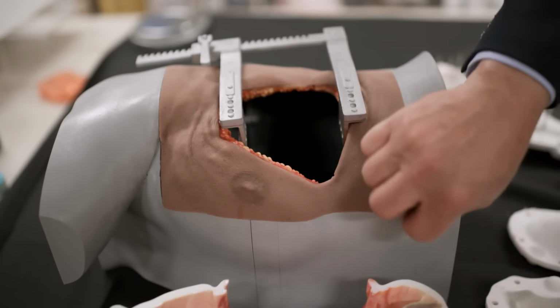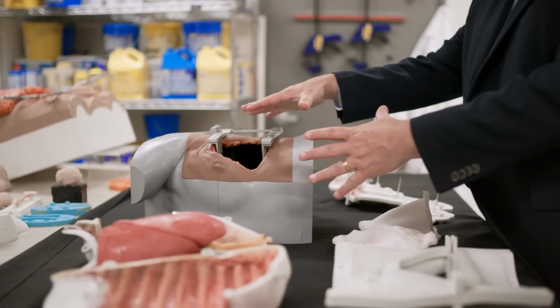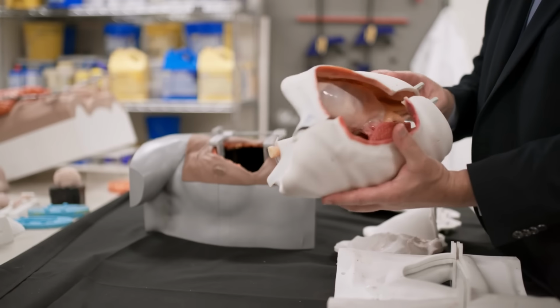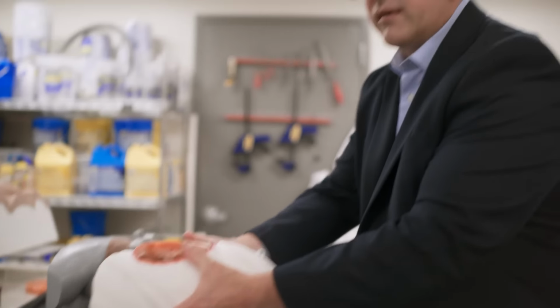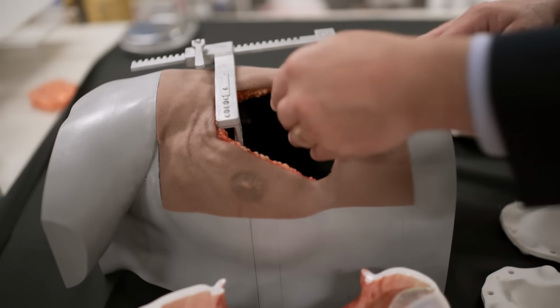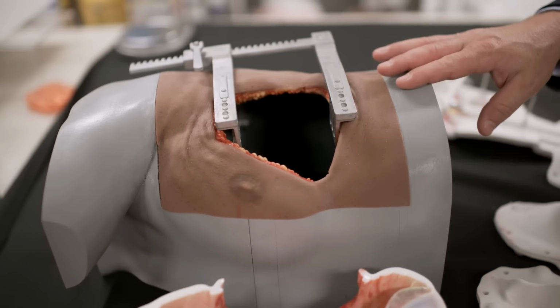This is a silicone molded skin that sits inside of a 3D printed base. The outside of this is what the practicing surgeon's going to see. This is going to be put together like that, and then it's going to be inside that cavity. So what the surgeon's going to see is this is going to be all toweled off. So then the surgeon will reach into the chest cavity and have to stop bleeding or other pulmonary trauma that we've built this for.